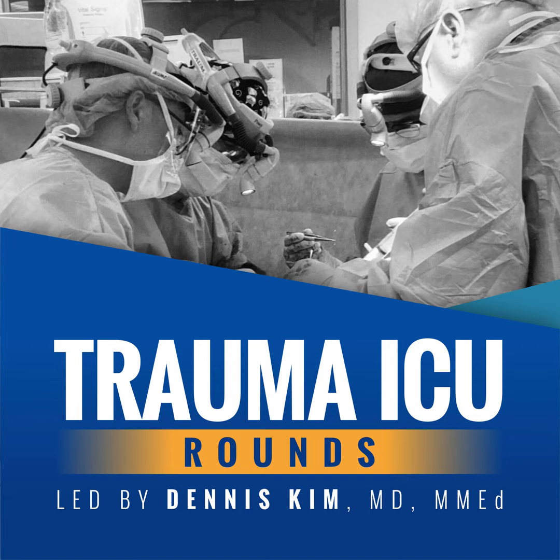This is really more of historical interest. I think in the vast majority of ICUs worldwide these days, if a patient appears to be ready for a spontaneous breathing trial, that patient would be placed on pressure support ventilation with anywhere from 5 to 10 centimeters of water to help overcome resistance within the ventilator circuit, and by the 30-minute or 120-minute mark would be extubated, provided that they meet all criteria for physical removal of that artificial airway.